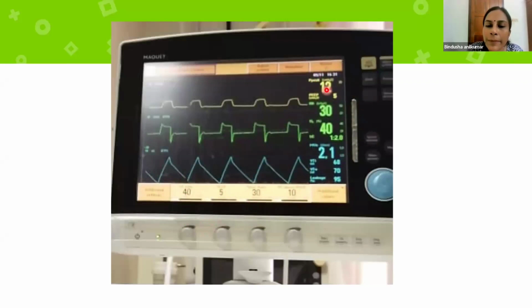Okay, here the P peak, what is being delivered, the measured P peak, will be shown. And you can see the set PEEP in the lower part. Here I'm not very sure what is being shown. Maybe PC above PEEP and this may be FiO2. I'm not very sure about what is being said. Okay, this is the respiratory rate and the delivered respiratory rate is also here. Since the patient is not having any spontaneous breath, whatever you set is what is being delivered.